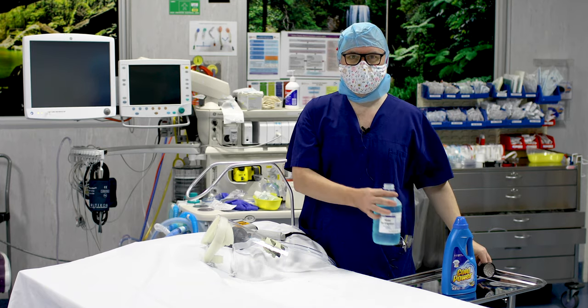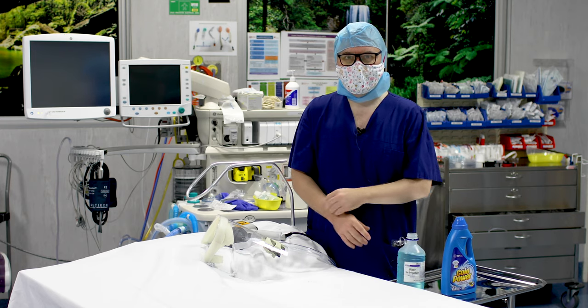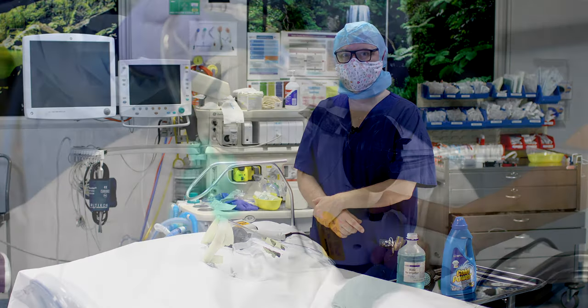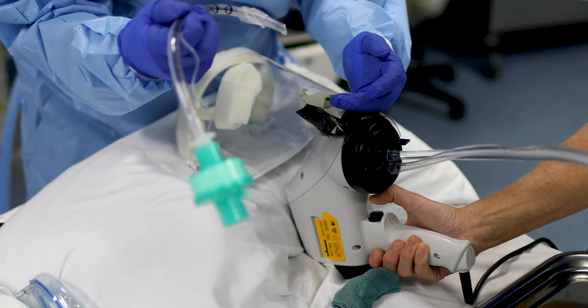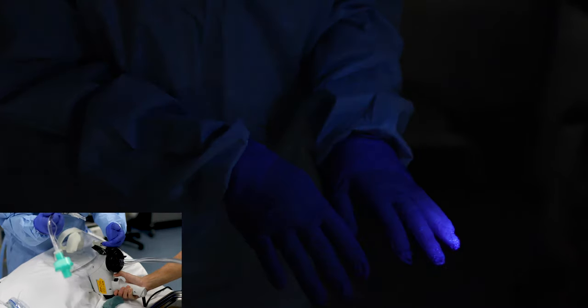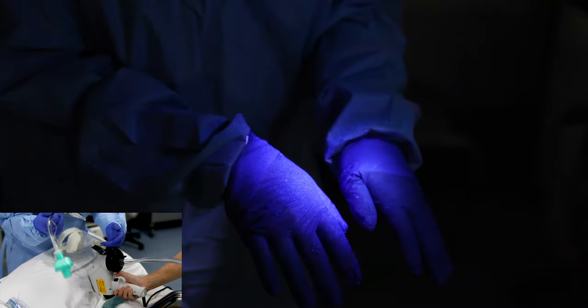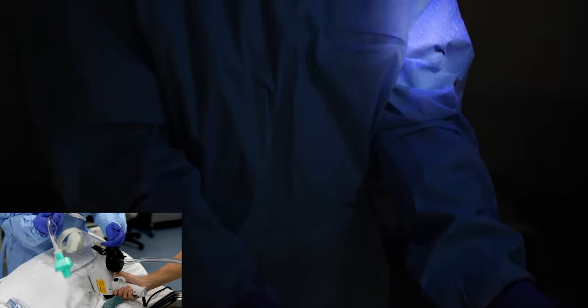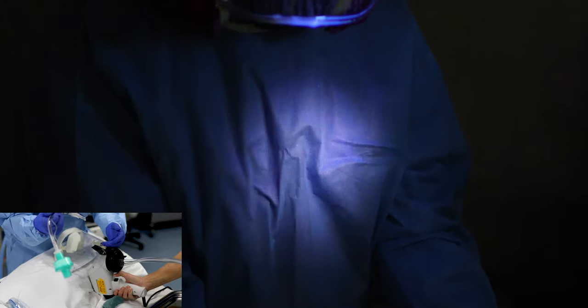For reasons which will soon become obvious, I'll be wearing a full face respirator during this test. This is a simulated cough during laryngoscopy. After the cough, we checked for contamination. The paint gun was adjusted to produce a 2 meter horizontal aerosol cloud. My face shield was wiped and checked for contamination, and I used a fresh gown and gloves for each test.